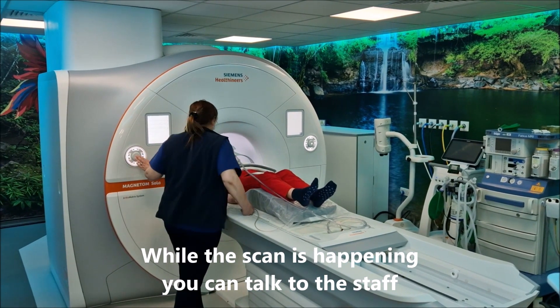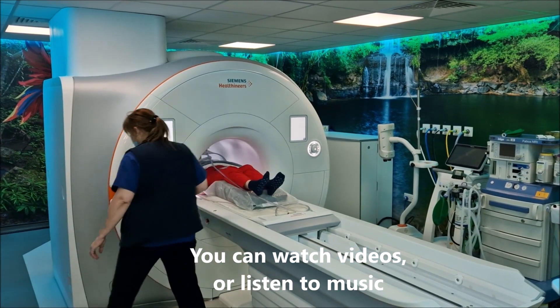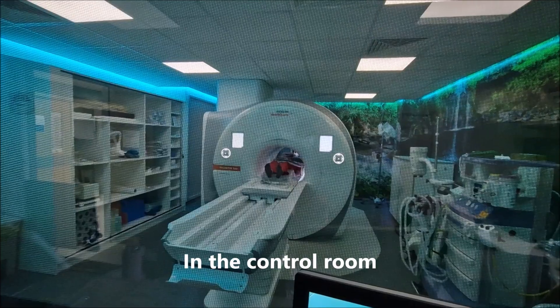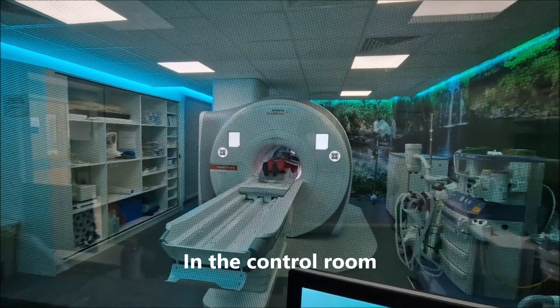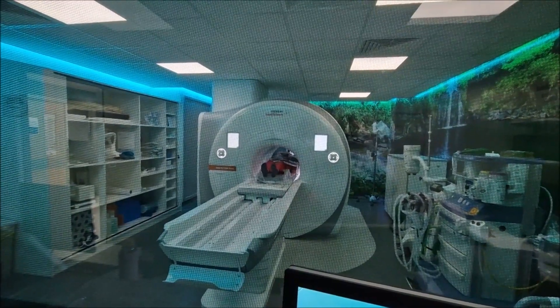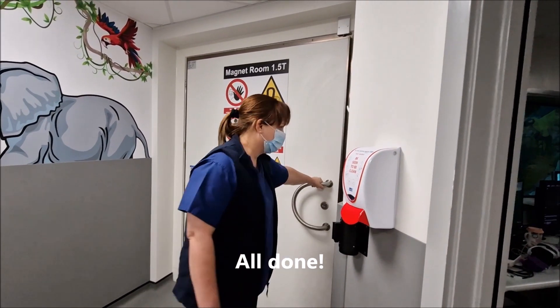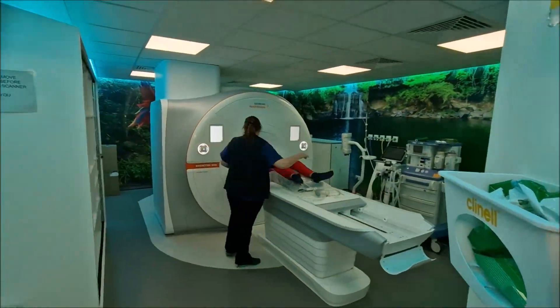We'll then slowly slide you into the scanner and once you're all the way in position you can see the movie really well. Your mum or dad could also sit at the other end so you can see them. A scan takes about 30 to 60 minutes depending on how much we need to image. When you're all done we'll get you back out.